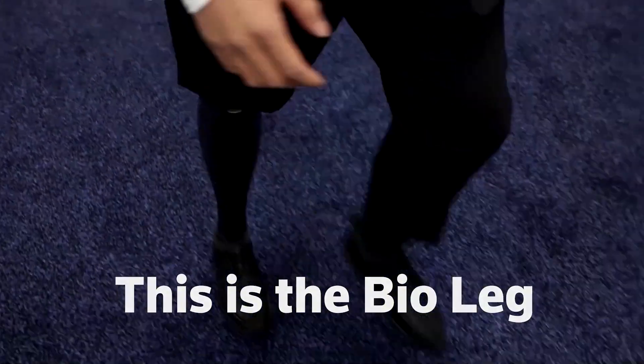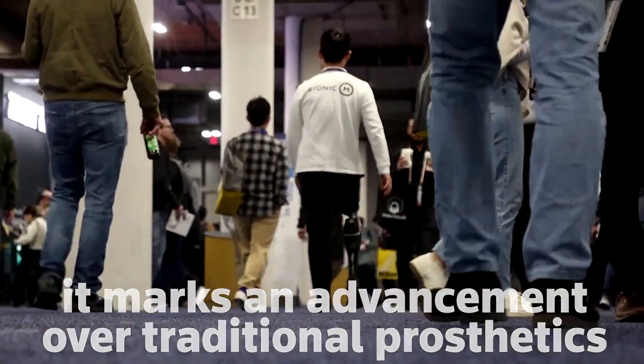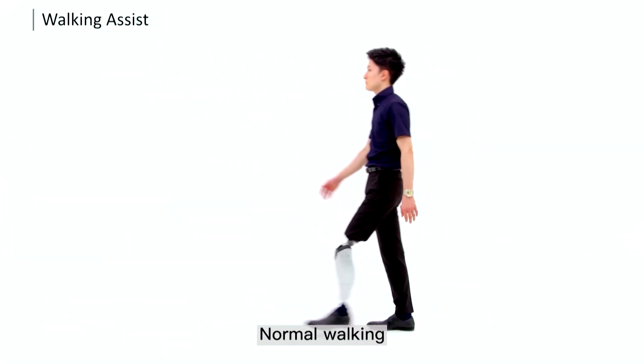This is the BioLeg, a groundbreaking prosthetic knee for amputees. Its creators say it marks an advancement over traditional prosthetics. The BioLeg uses sensors, motors, and a battery to help the user move in real time. Its technology aims to help amputees walk more naturally.